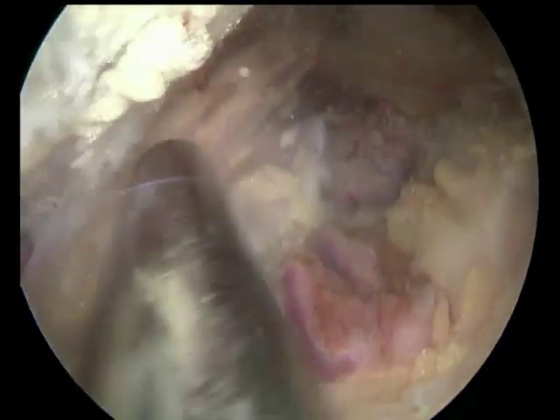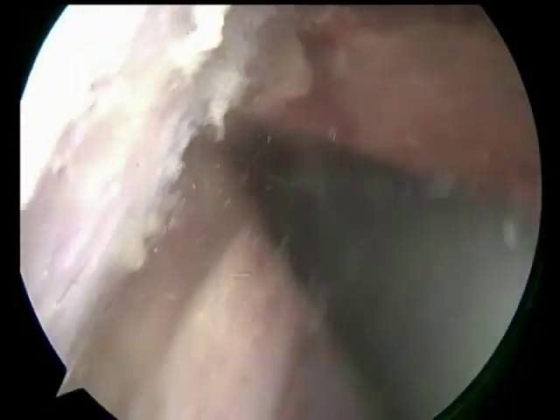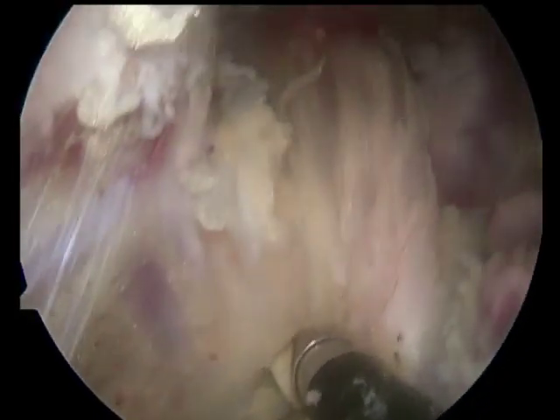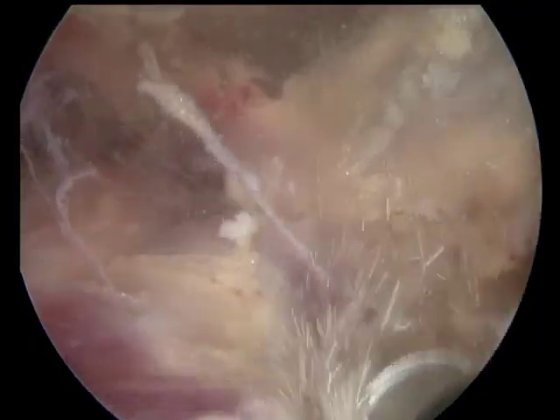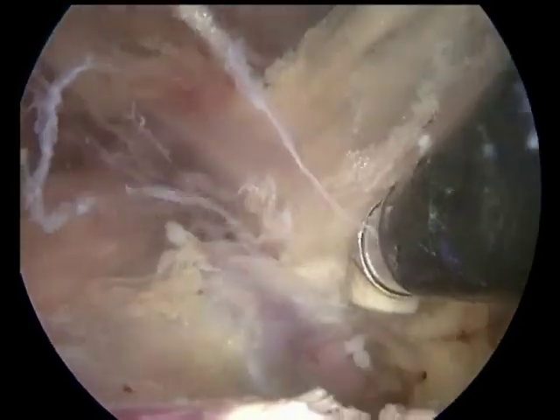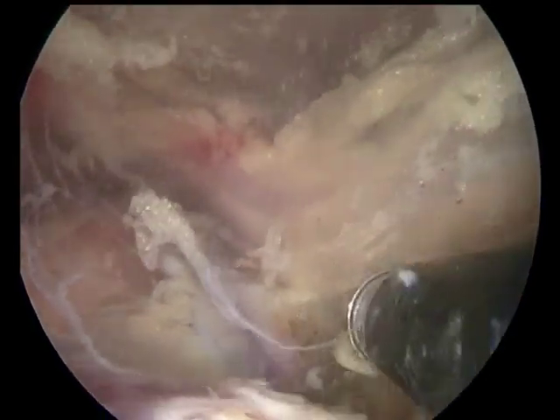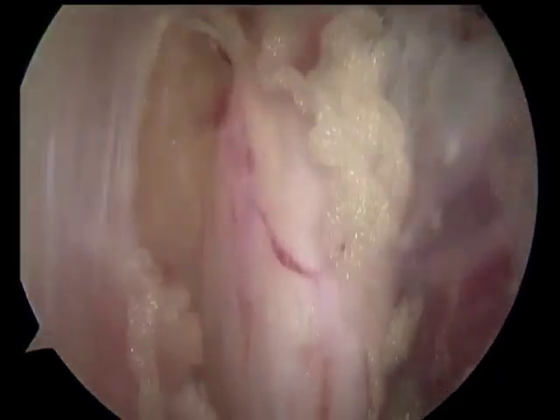Then we continue our release bluntly with the obturator. We can also switch back to the ablator. And our goal is to remove all adhesions and all scars around the sciatic nerve. We also can make more release of the rotator muscles. We add a little bit myotomy to decrease tension.